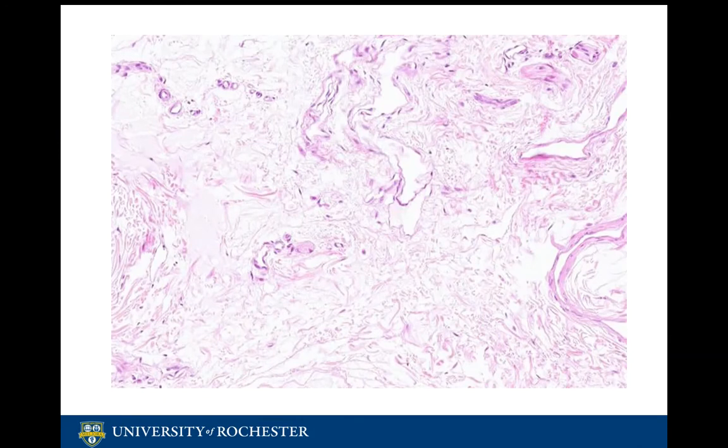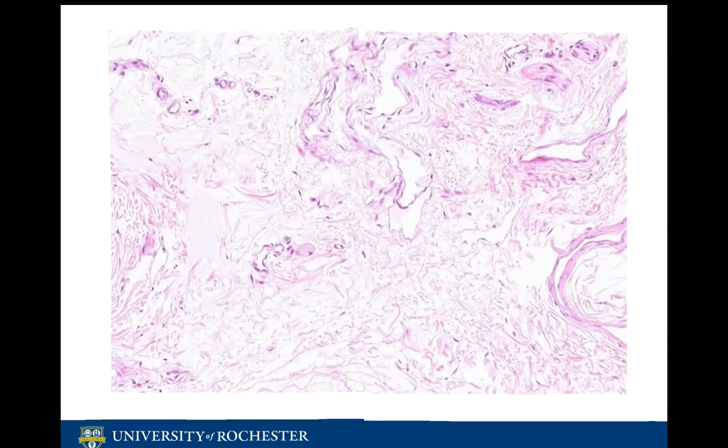Connective tissue. The outermost layer of the trachea is the adventitia connective tissue, which loosely connects the trachea to the surrounding tissues.